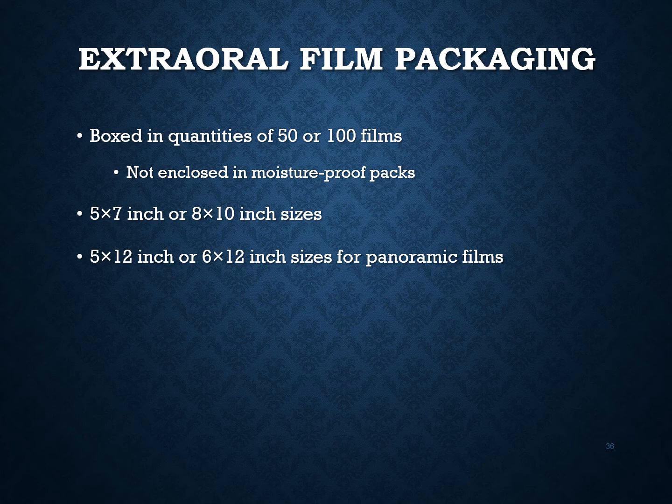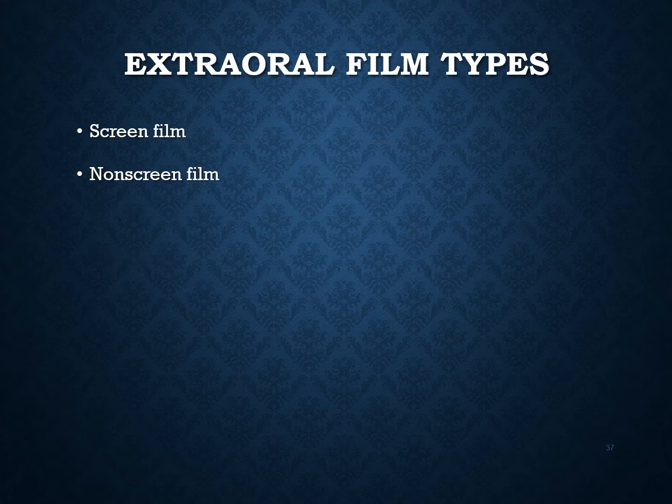It is advisable to seal an opened box with a rubber band to ensure that the cover doesn't accidentally fall off and ruin the box of film. Labels on the box of extraoral film include information like the type of film, the film size, the total number of films enclosed, and again, that expiration date, because films expire. Okay, so there are two types of extraoral films. There are screen films and non-screen films.